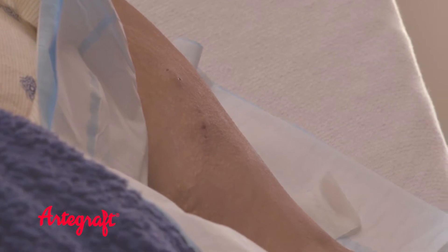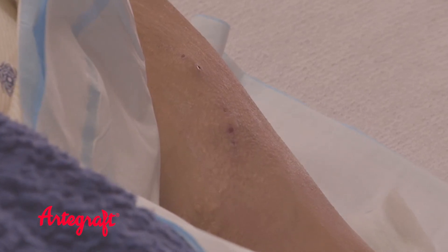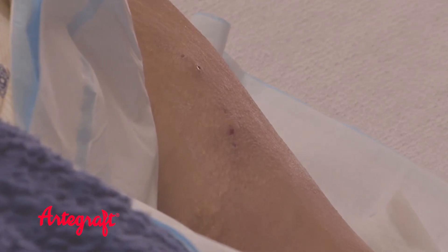First we are going to do the one minute check. You want to look for any changes in the extremity, fingertips to shoulder, or toes to groin. Check the skin integrity and see if there's any bruising or development of a hematoma. You want to check for steal syndrome or any discoloration, cold or blue fingers. Lastly, look to check the surgical incision to make sure it is still intact and free of infection.